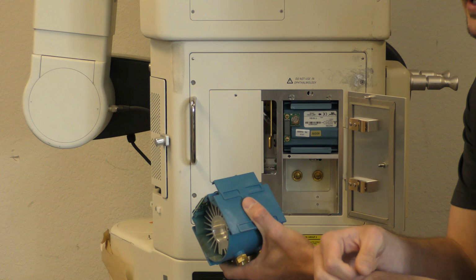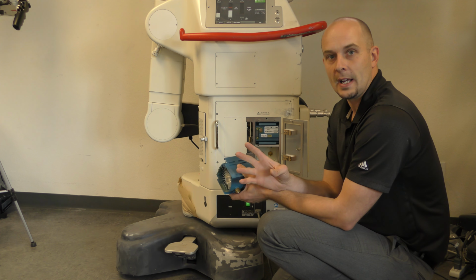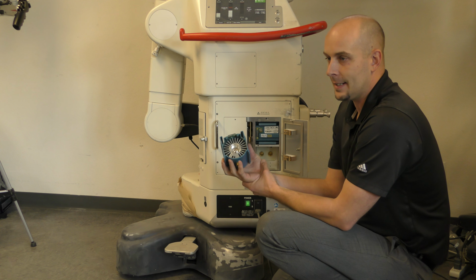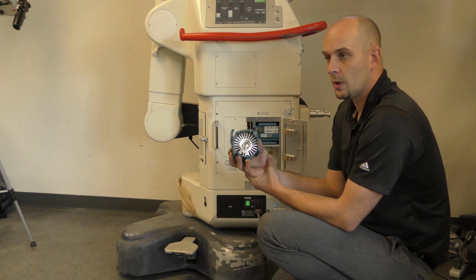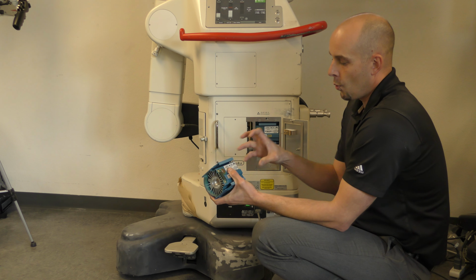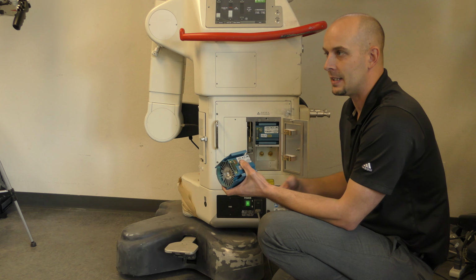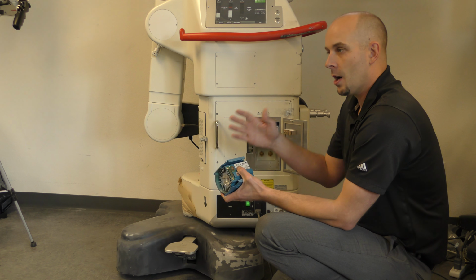So in a halogen bulb system, if we were looking at that, a halogen bulb's going to burn out. It's not going to wreak any major havoc on the microscope electronics when it does that. In the case of a xenon bulb, it's gas, and it doesn't typically burn out. So they'll run upwards towards 2,000 hours. When they do that, they draw more power from the power supply, and that power supply starts to just fail. It can't keep on giving this major output of energy to a dead bulb over a long period of time.